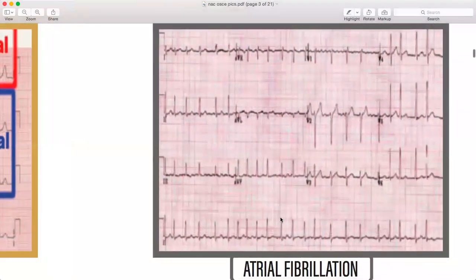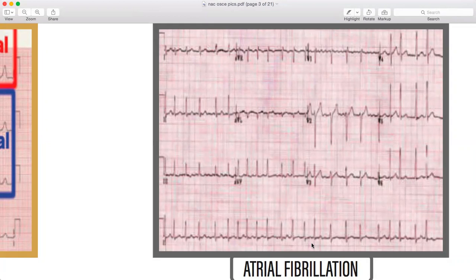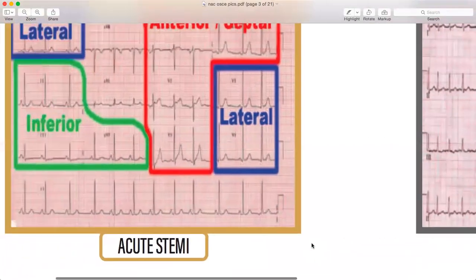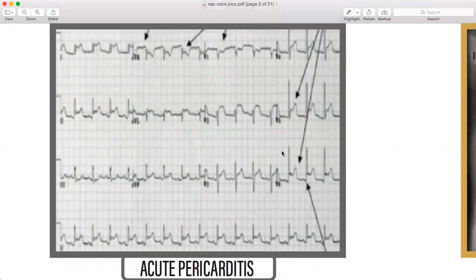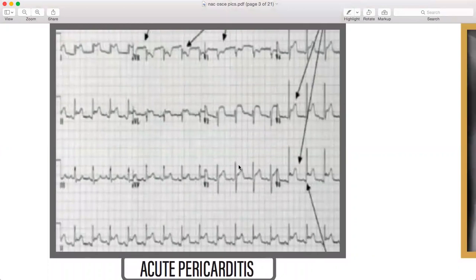Atrial fibrillation has no P wave and an irregularly irregular rhythm — this is very important, don't forget the ECG of atrial fibrillation. Then acute pericarditis — note where the ST elevation and PR depression are. See the ECGs of both acute and chronic pericarditis.